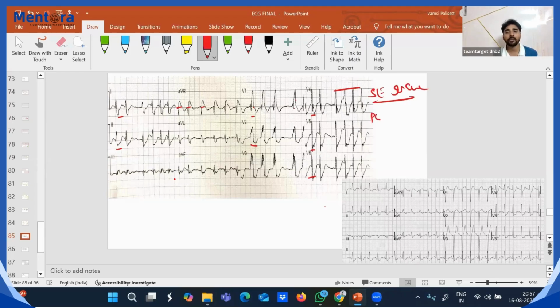Usually this happens in post cardiac arrest. Anytime a patient undergoes cardiac arrest, you need CPR. So he already has hypoxia, subendocardial ischemia is there. All the leads will show depression. Then, because of reciprocal changes, we are seeing ST elevation. It's not a STEMI equivalent. Don't treat it like a STEMI. If you observe, anytime after CPR when the patient is revived, his rhythm will be like this: AVR ST elevation. Not thrombolysis. It's not a STEMI equivalent. It's only subendocardial ischemia because of hypoxia. Okay.